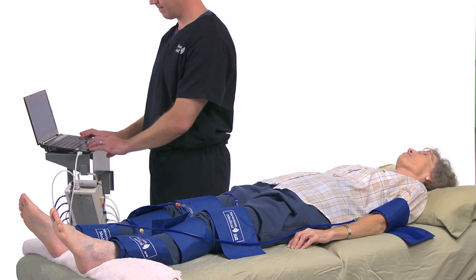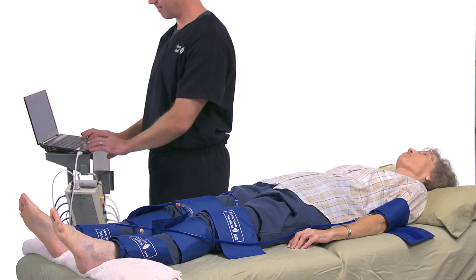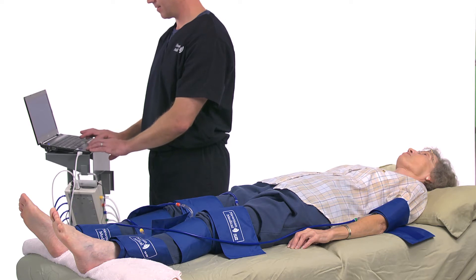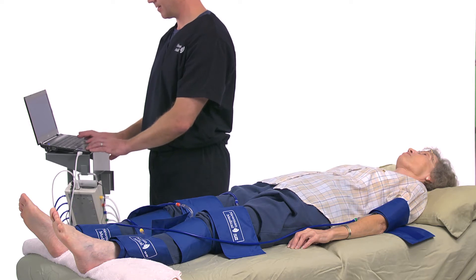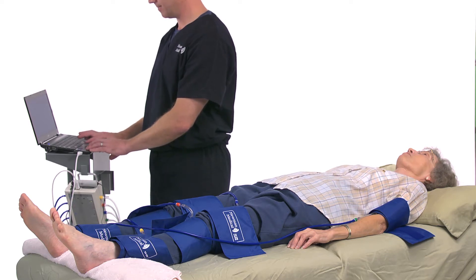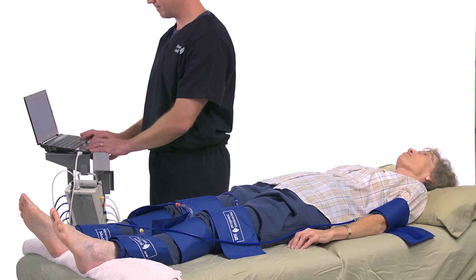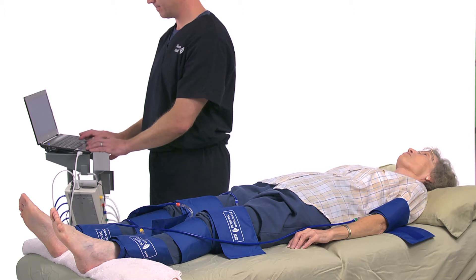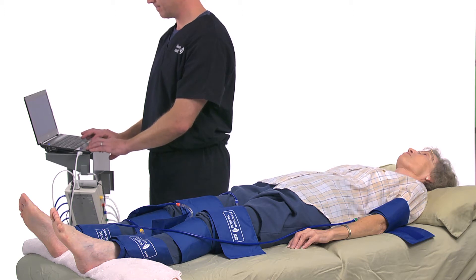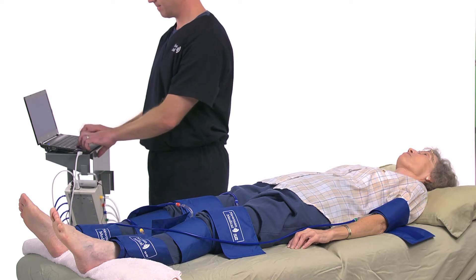Have the patient lie down in the supine position, relaxed with head and heel supported in a comfortably warm room. Wrap appropriate sized cuffs — usually 12 cm on the arms and 10 cm on the ankles — as explained in the section on cuff wrapping.